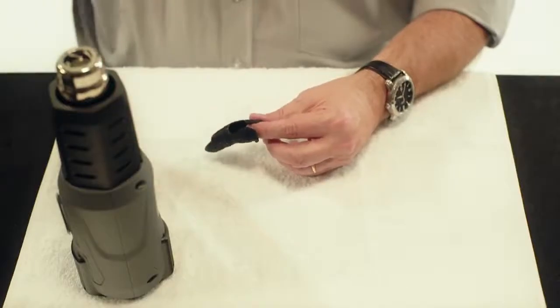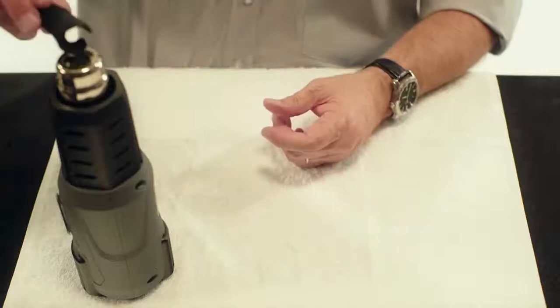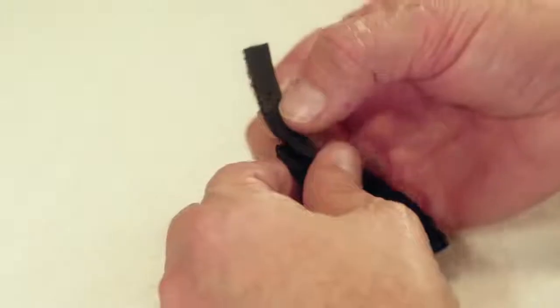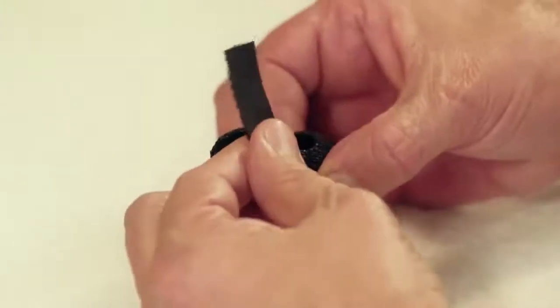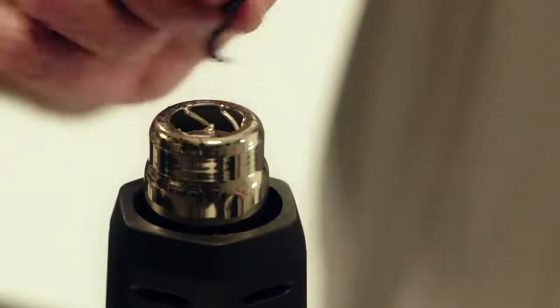To attach the Velcro loop directly to the orthosis, heat the Orficast material and adhere the Velcro loop. Secure it by heating a small piece of Orficast with the heat gun and stick it on the edge of the Velcro loop.